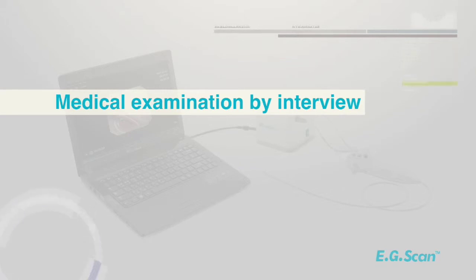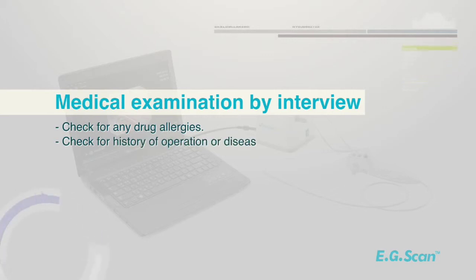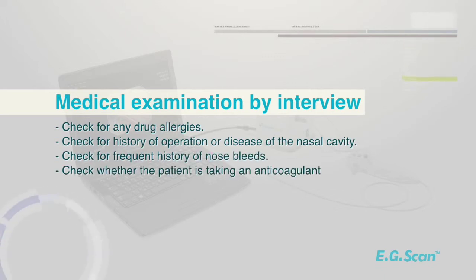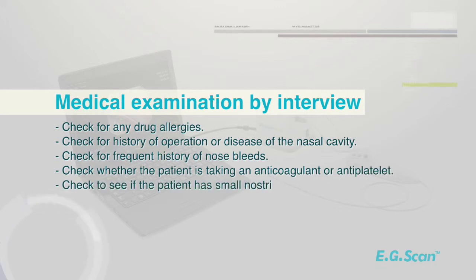Medical examination by interview. Check for any drug allergies. Check for history of operation or disease of the nasal cavity. Check for frequent history of nosebleeds. Check whether the patient is taking an anticoagulant or antiplatelet. Check to see if the patient has small nostrils or stuffy nose.